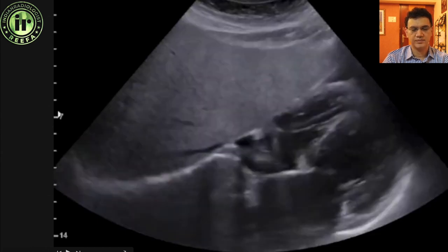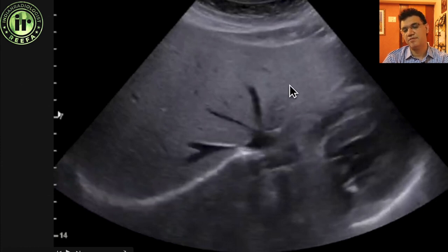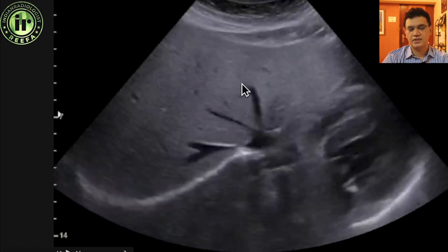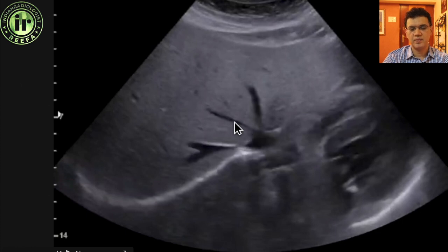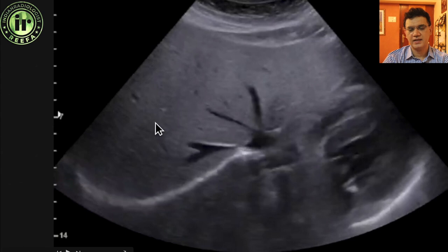Pausing here, you can see the left hepatic vein, middle hepatic vein, and right hepatic vein. The segment to the left of the left hepatic vein becomes segment 2. Between the left and middle hepatic veins becomes segment 4 — specifically 4a because it is at a superior level. The segment between the middle hepatic vein and the right hepatic vein will be segment 8, and the one to the right of the right hepatic vein will be segment 7. So we have 2, 4a, 8 and 7.